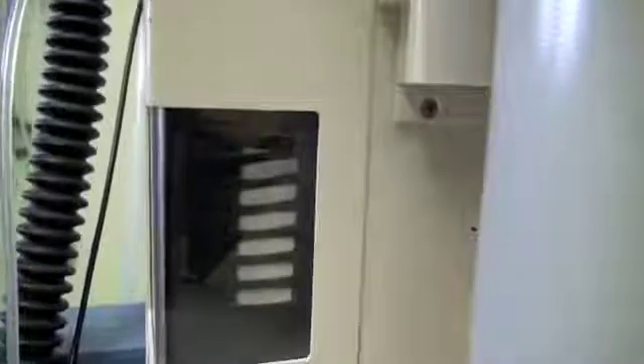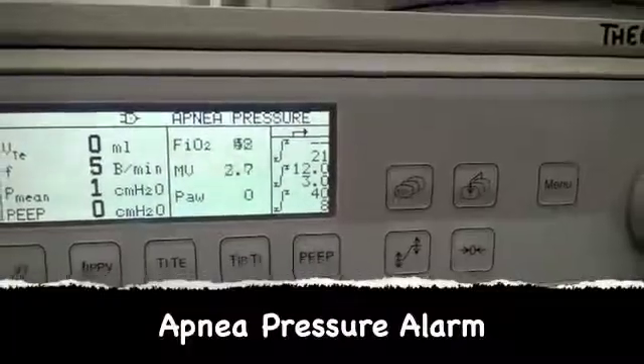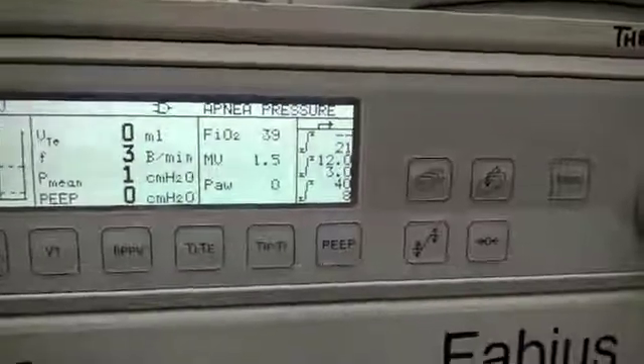If there is a leak, the bellows will empty and won't refill. Another safety feature of the machine is the apnea pressure alarm, which usually indicates that there is a leak within the system.